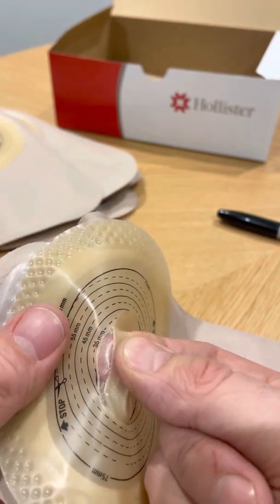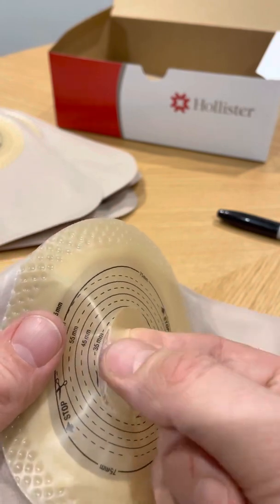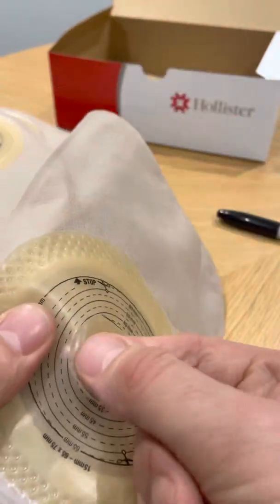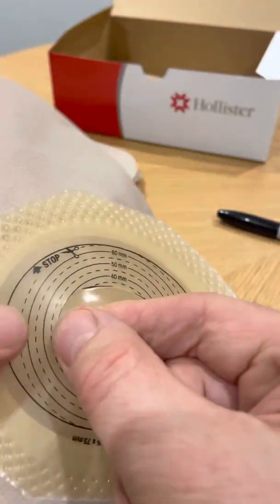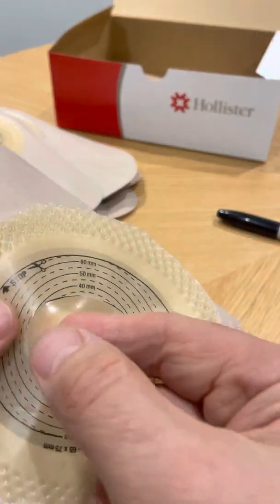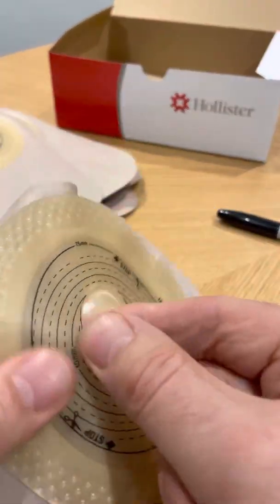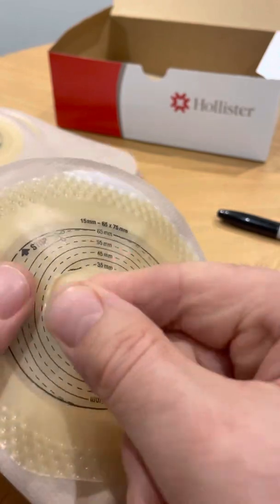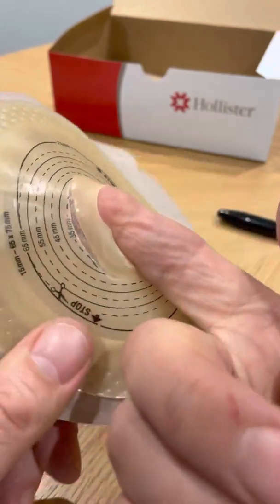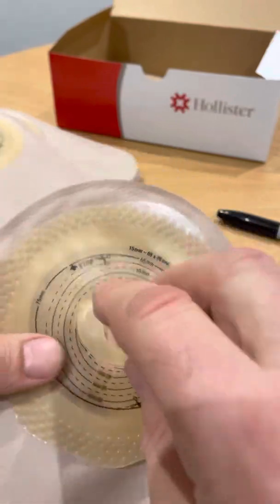You can still see it's shiny, you can still see the material through the gap, contrasted with your finger as you go round. And just pull, don't pull this bit, you don't want to distort this section, you're only pulling this bit which is going to be discarded. So I'm just pulling that away, but I'm also checking that there's no puncture or cut that's gone all the way through, and that's fine.